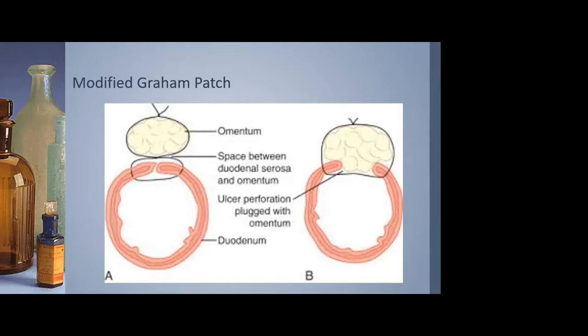The other thing you can do, if you don't want to go through the omentum twice first and then address the duodenum, you can go once through the omentum and then stick a clip on your stitch, and that'll hold that also somewhat in the omentum. Obviously, it depends on how bulky your omentum is, how much stitch you need to do, and how much kind of wraps through the omentum to manage that omentum.